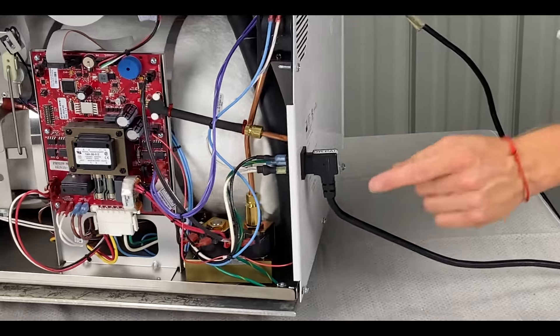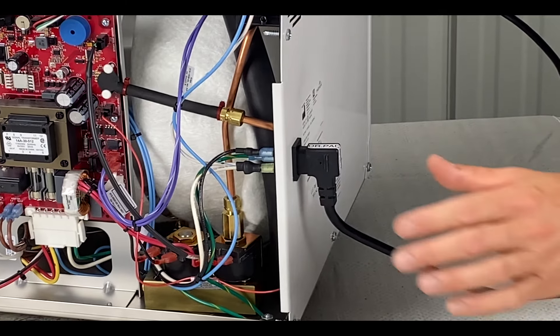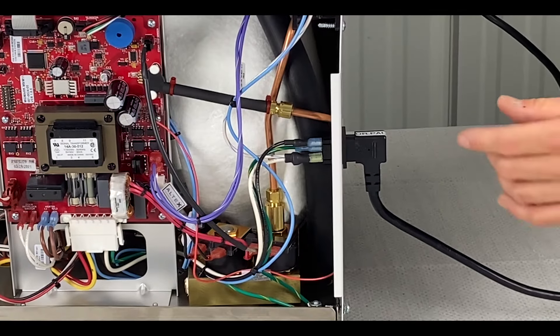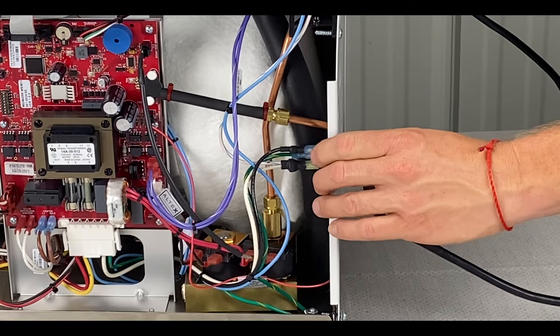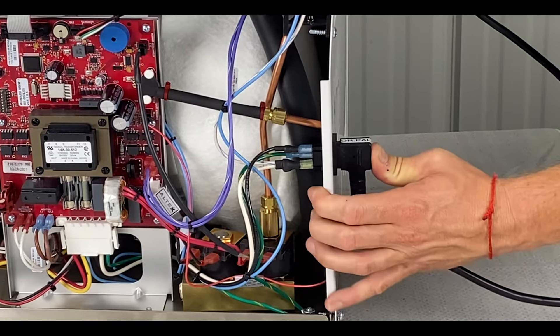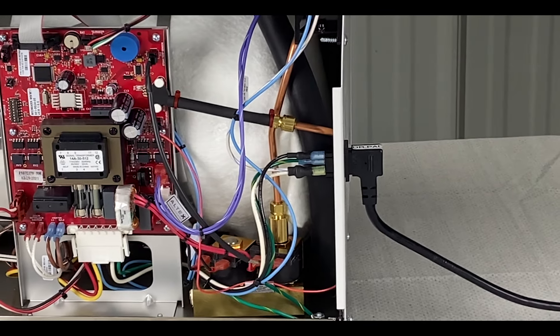Also, this connector here — if you don't push it in all the way, see how it's basically just touching on the edge — or as you're sliding it in and out of a cabinet, these things kind of pull loose. So you're going to want to push it in all the way. Make sure it's in all the way so that you don't get intermittent power interruption errors.